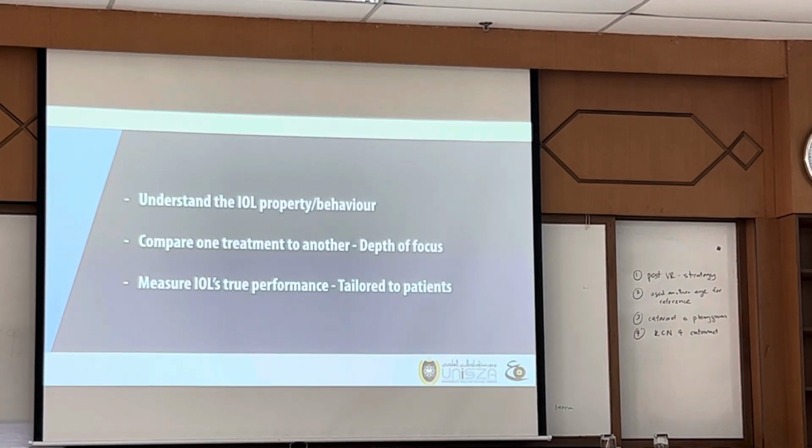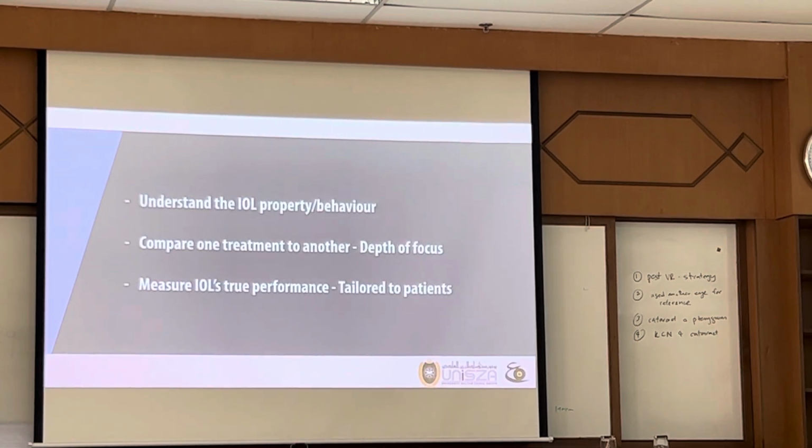So the defocus curve is how we understand the IOL behavior, and we can also compare one IOL to another IOL, one method to a different method, and see how far the depth of focus this IOL provides. We can also measure the IOL's performance, and by knowing this, we can tailor the IOL based on what the patient needs.